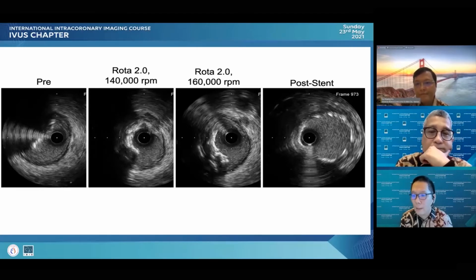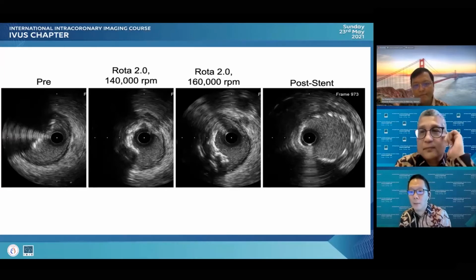They said the expansion of the stent is the same, but I still like this technique for my practice. If I face slow flow, I use intracoronary adenosine injection during the procedure to make the flow better before doing the next run. These are my key techniques.